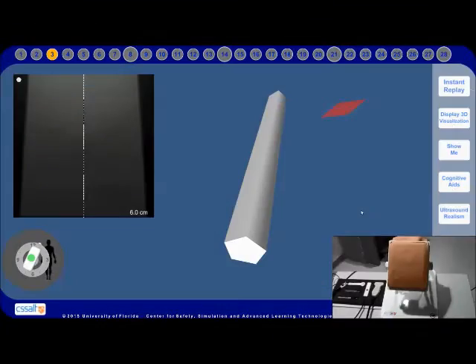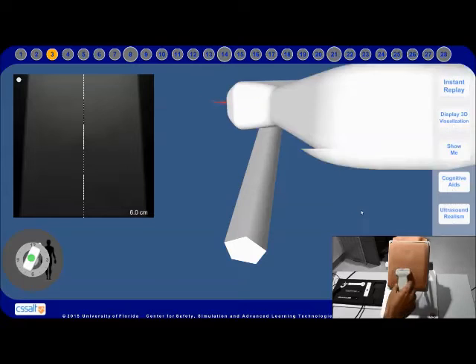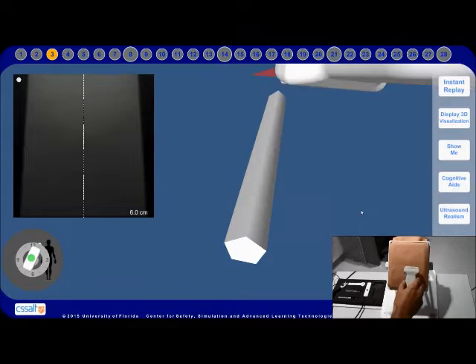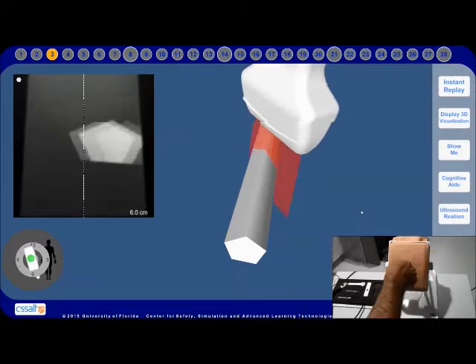We have developed an ultrasound simulator that uses virtual objects embedded in an ultrasound phantom. Cross sections are generated on the fly using a simulated ultrasound probe that is tracked in space with 6 degrees of freedom.